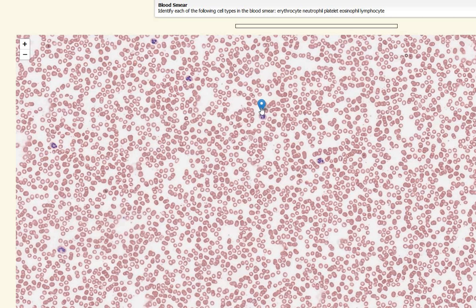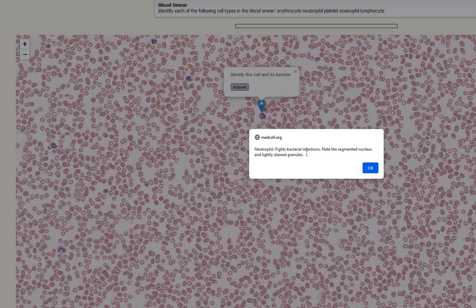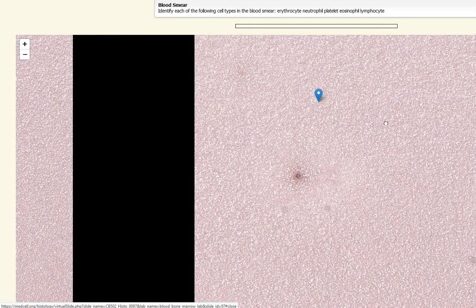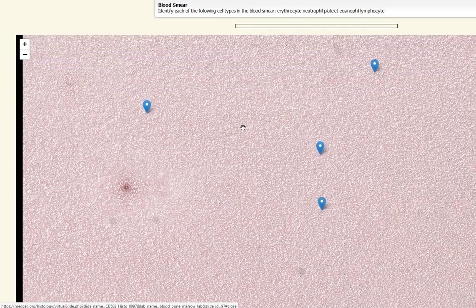If you're still not sure after going through that process, you can click here, and it will give you that answer, as well as a little bonus information. So that is how I would recommend you practice. So, found our neutrophil. Let's keep going.